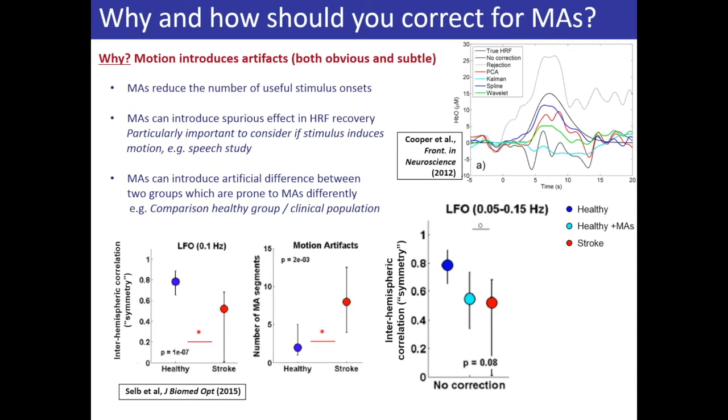So Juliet did something interesting. She took the motion artifacts, or those parts of the signal from stroke patients, and literally added them to healthy subject data, and then did her analysis. And this is without any correction or removal. Here you see, now this cyan one is healthy plus motion artifact. And now actually we lost the significance in difference between hemispheric correlation.